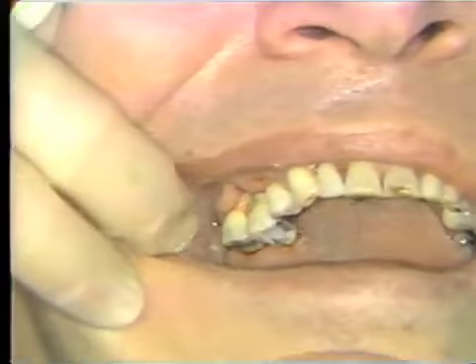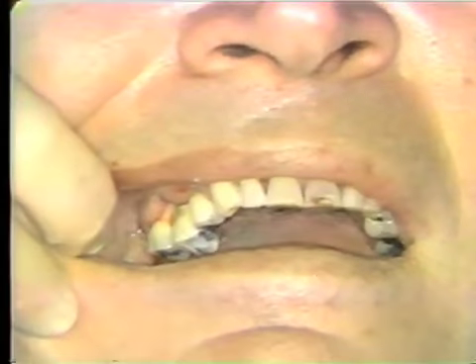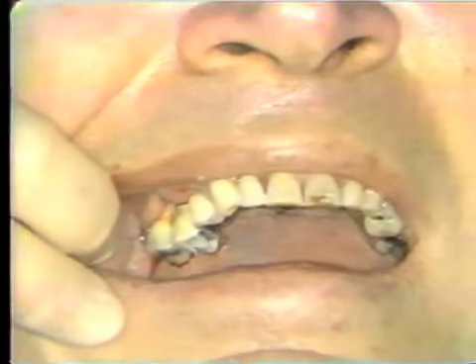Okay. You have a mirror, old tiny mirror. Okay.